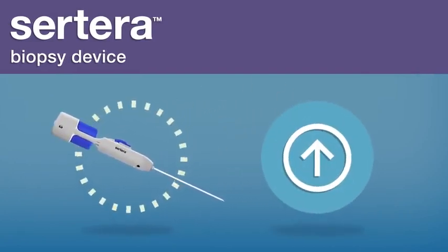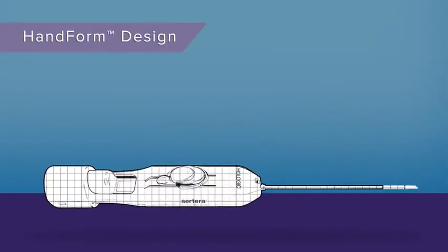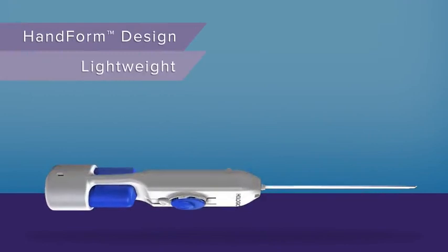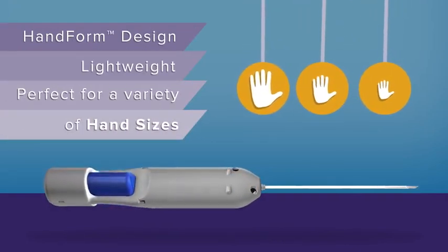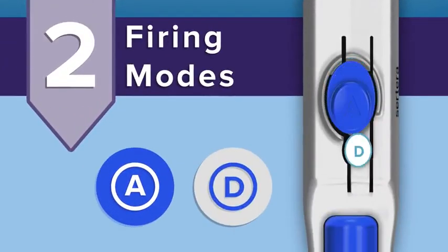Our unique hand form design enables one-handed arming and firing, and the ergonomic and lightweight device fits comfortably in a variety of hand sizes. Two firing modes provide precise control, allowing you to confidently verify the sampling area under ultrasound.